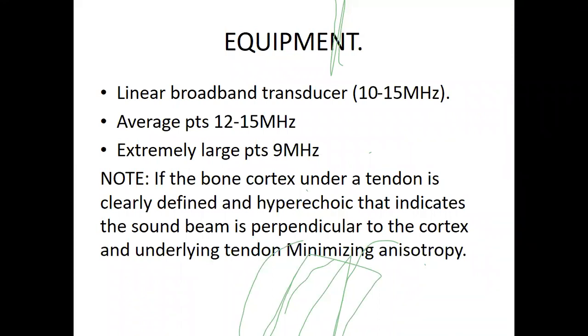I cannot overemphasize that a thorough clinical examination is very, very key. Patients who present with shoulder joint pain tend to have non-specific shoulder pain. However, sometimes patients may have specific pain that they present with when they come to your department. But if you have a systematic, logical way of assessment, it should take 15 minutes maximum.